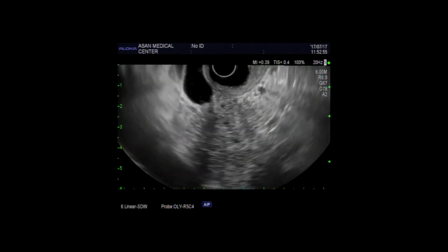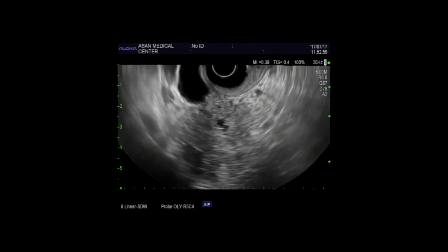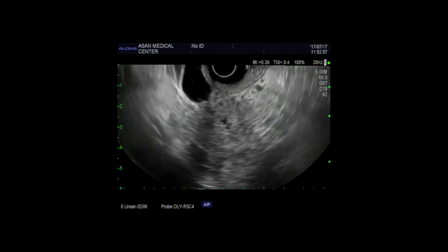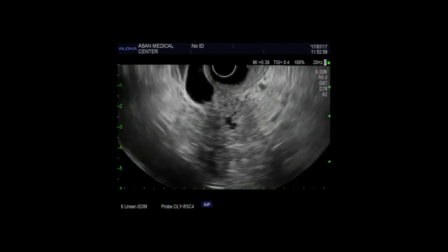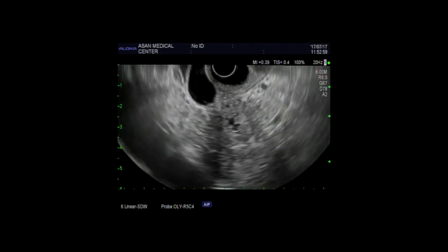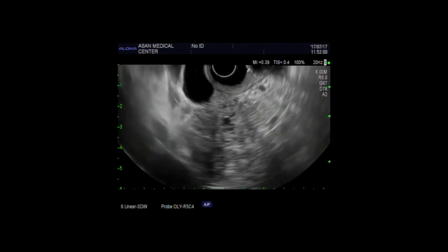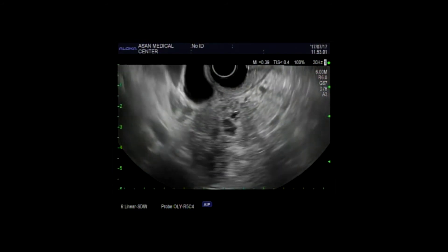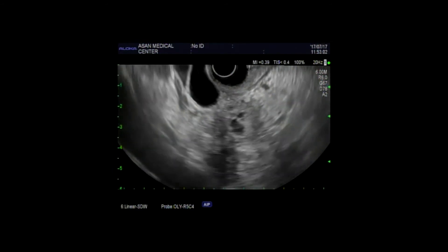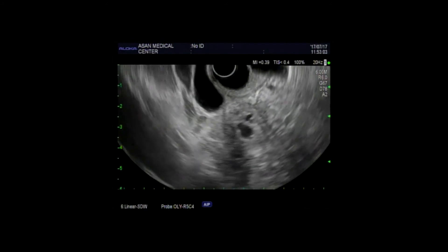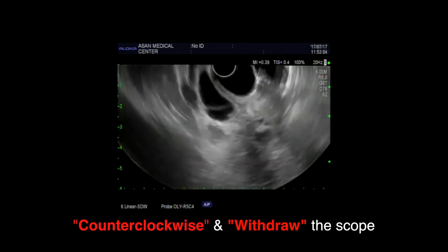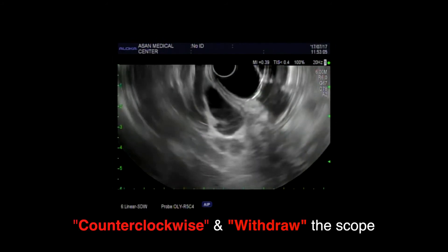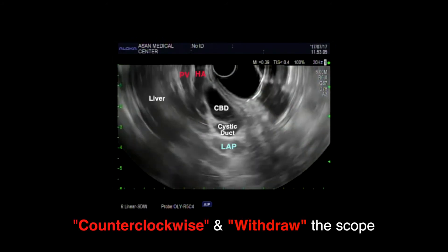In this case, we can find the CBD was dilated and there is an ill-defined hypoechoic lesion in the head of the pancreas. While slightly counterclockwise and withdrawing the scope, we can see the hepatic hilar portion.